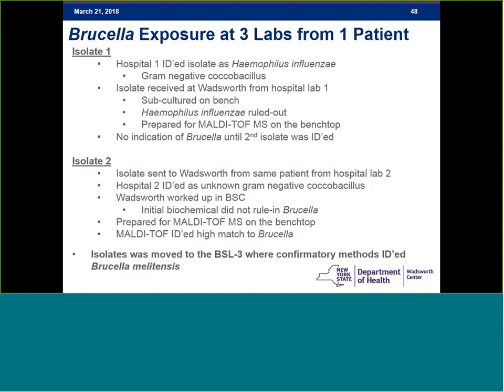Simultaneously, while we were working on the first isolate, a second isolate from the same patient was being worked on as the same patient ended up going to a second hospital. Hospital 2 couldn't identify the isolate and submitted it to the Wadsworth Center as an unknown gram-negative coccobacillus.